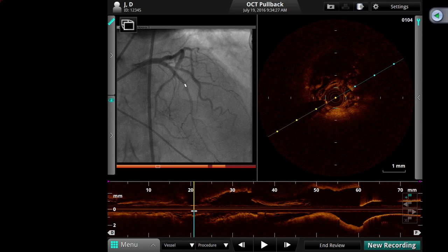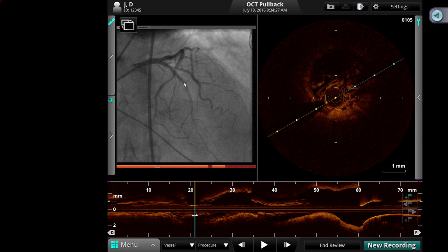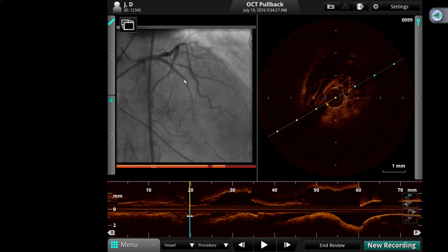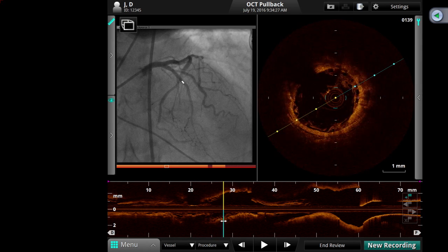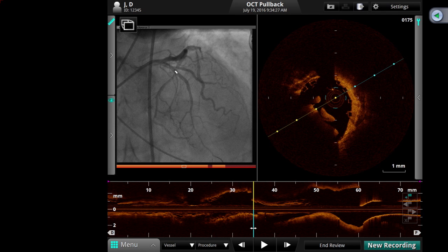I mean, we could not go more than this. We give 5 at 15. Bigger vessel, yep. No, come back, proximal. There's no stent there. I mean, okay, right there. You happy with the expansion there? Yes. Okay.